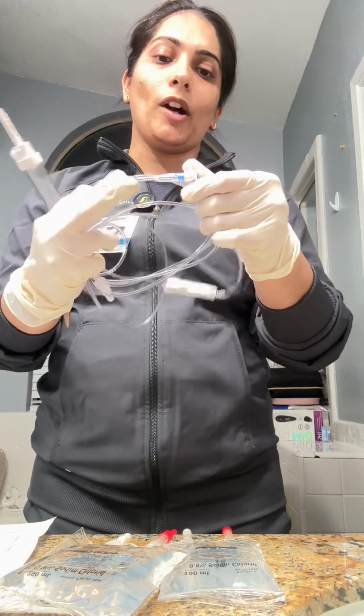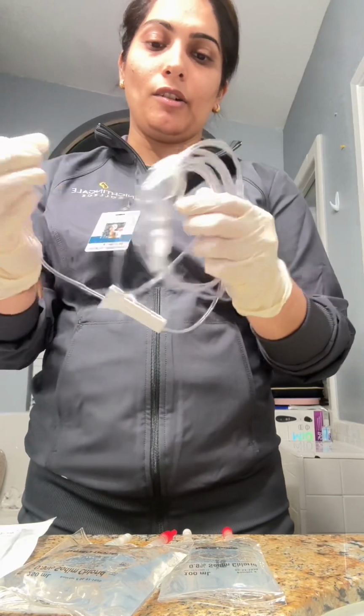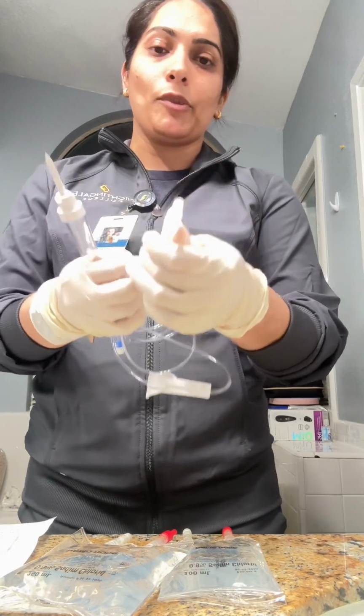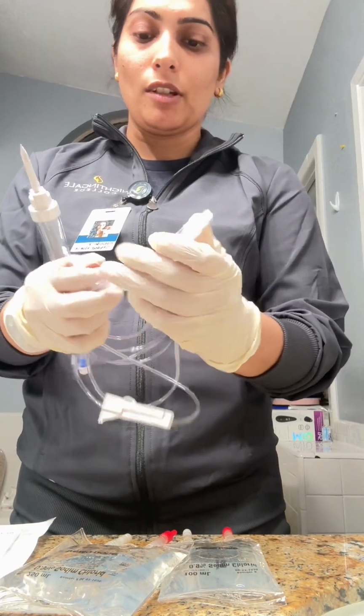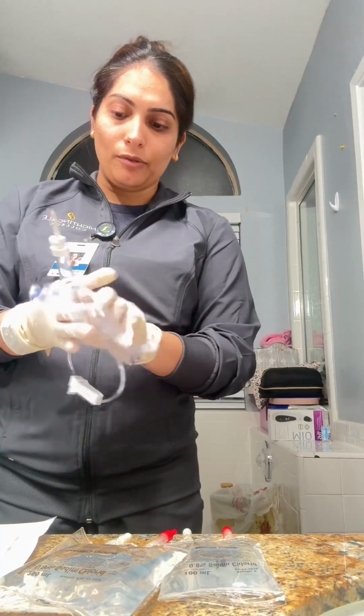This is the white port right here, and this is the adapter that connects to our patient. So I will be priming my IV right now.